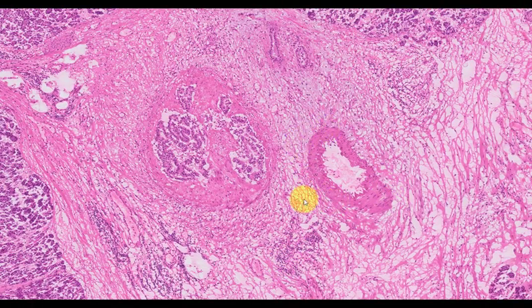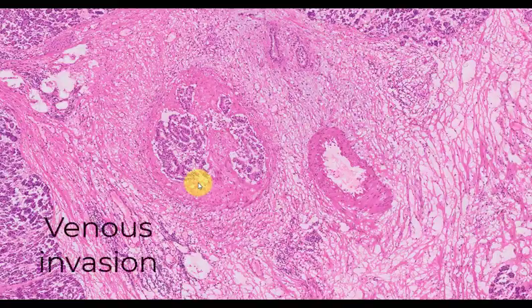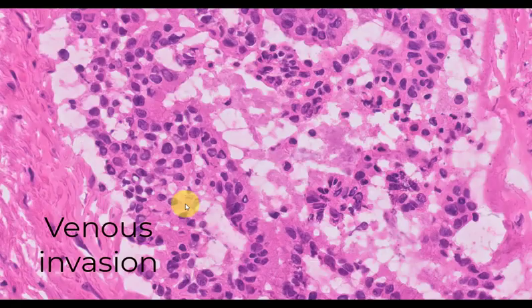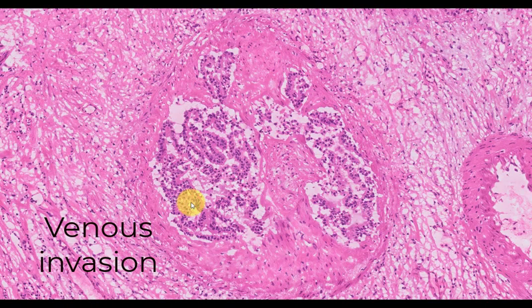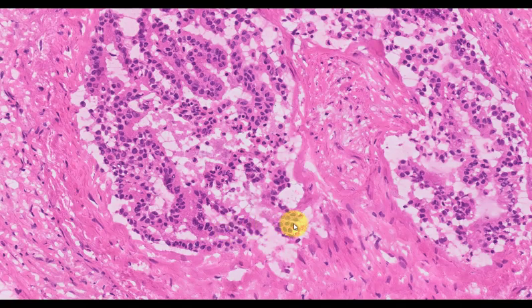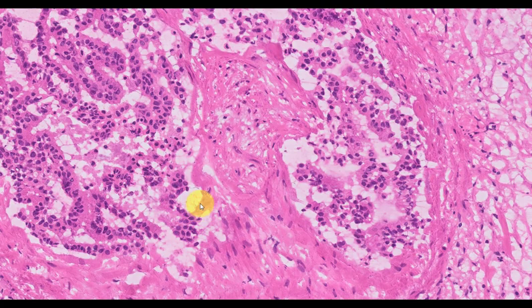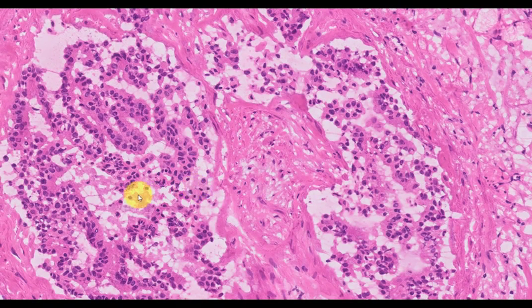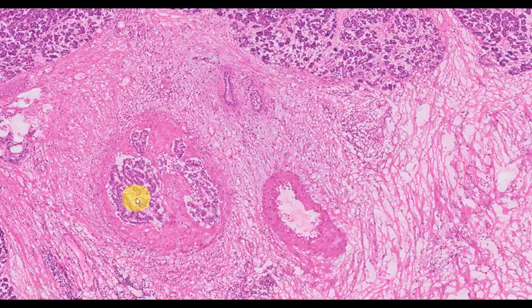Here's an arterial channel. Here's a venous channel. So this is a vein. This is intravascular invasion. And although this looks very monotonous, the mere presence of this cancer within the venous channel is diagnostic of cancer. You could argue that this is a push artifact, although given the amount of tumor in there, and given the relative absence of tumor in the adjacent pancreas, suggests to me that this is not a push, that this is indeed true intravascular invasion.